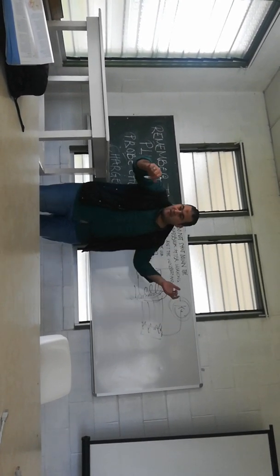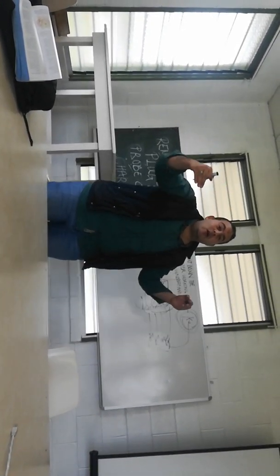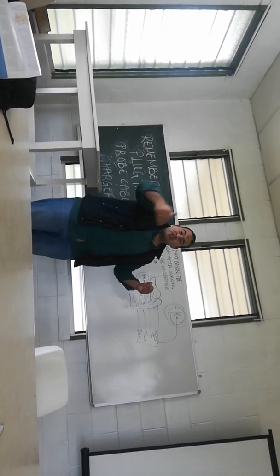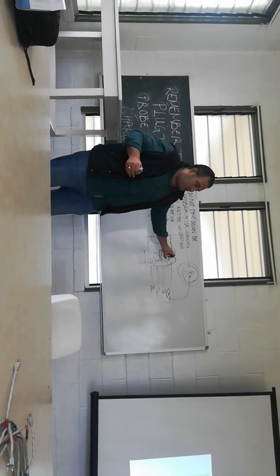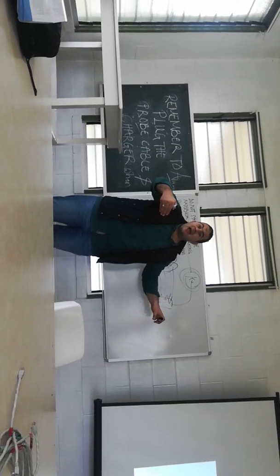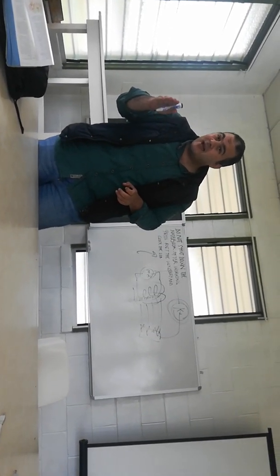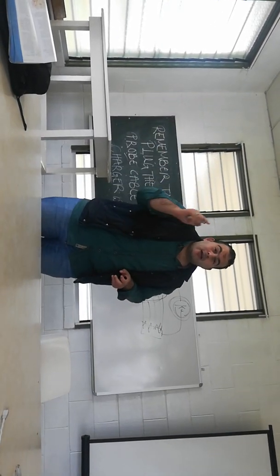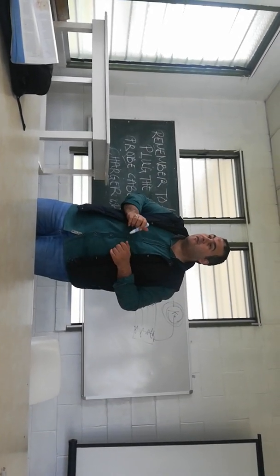If we set the kV value to 80 kV or 100 kV or 120 kV, what will happen? The acceleration increases, and due to this acceleration, the probability of interactions between electrons and anode will be increased, and the penetration power of the X-ray photons produced from the anode will be increased. So kV directly affects the penetration power of X-ray photons.